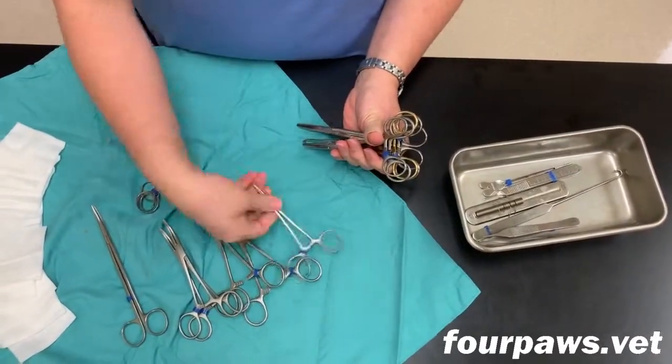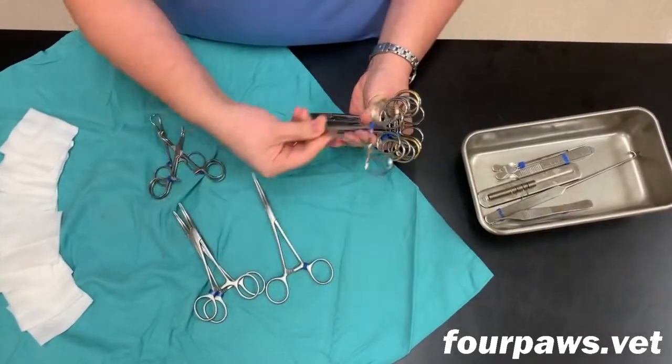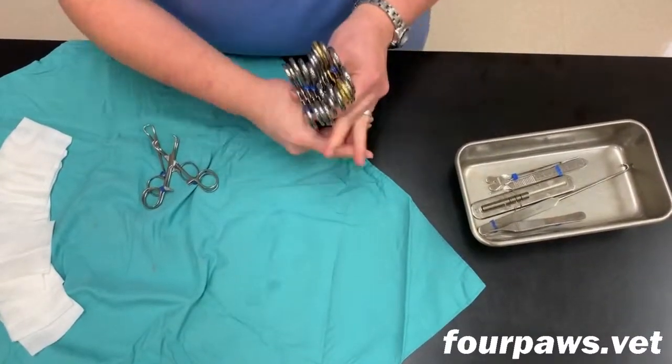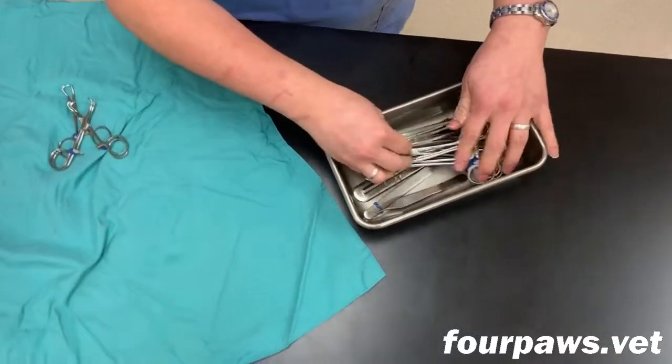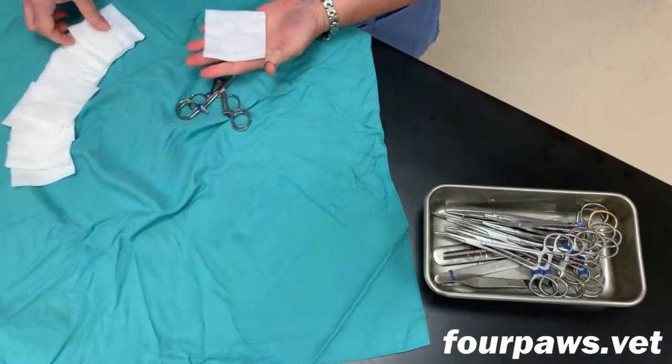Once you have collected all the appropriate instruments, then they can be transferred into the metal tray. The instruments are loaded in a particular fashion every time so that they're in the same order every time when you unwrap the pack.